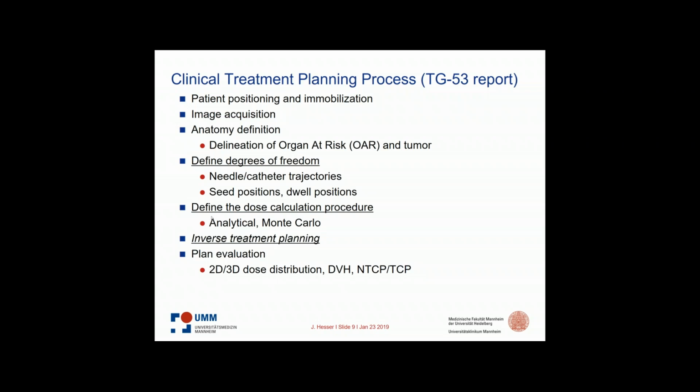The other parts, degrees of freedom, dose calculation, inverse treatment planning, and plan evaluation, are always the same. At the end, the way you do plan evaluation can be the same as for teletherapy. It depends on your internal approach, and you can go to this report to see what they recommend and stick to that as much as it makes sense for you.